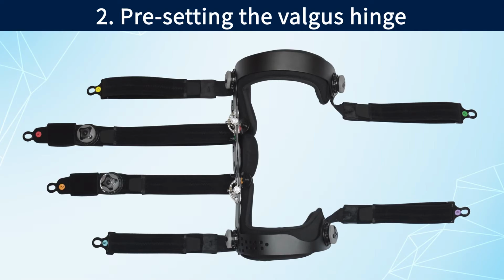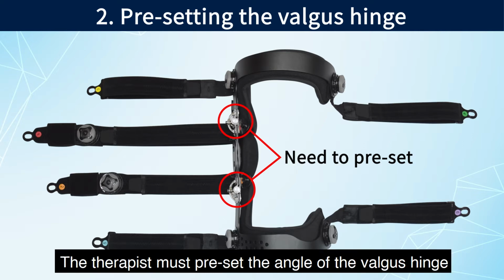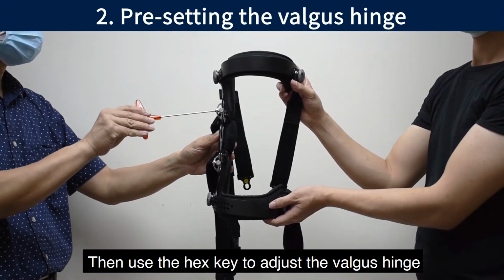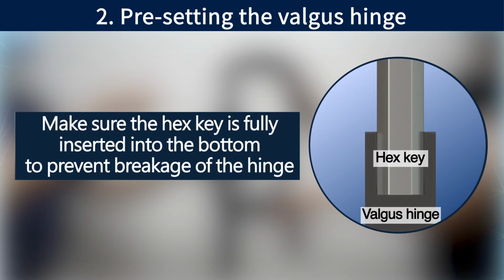2. Presetting the valgus hinge. Before initial fitting, the therapist must preset the angle of the valgus hinge. First, measure the angle of deformity of the affected knee as shown. Then use the hex key to adjust the valgus hinge. Make sure the hex key is fully inserted to the bottom in order to prevent breakage of the hinge.